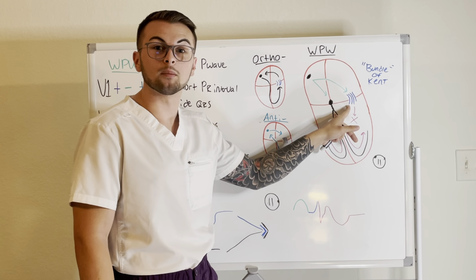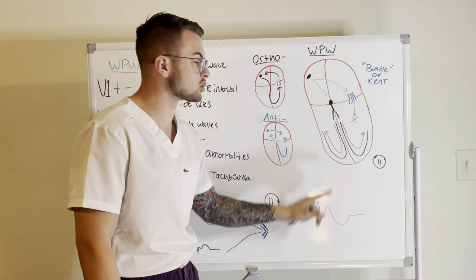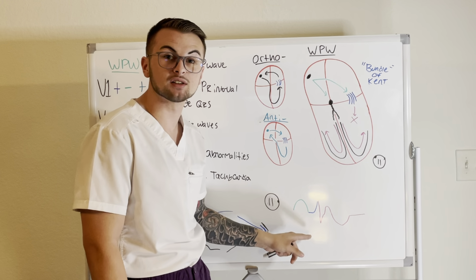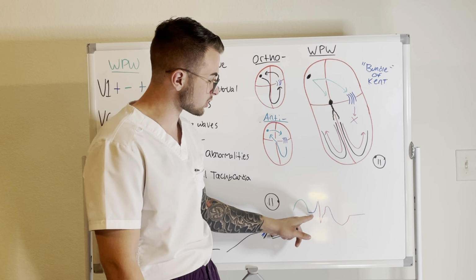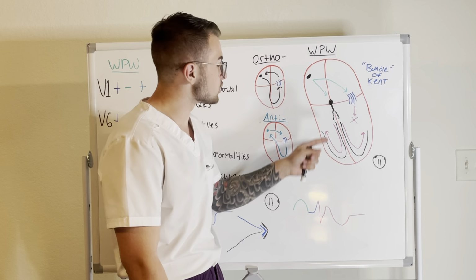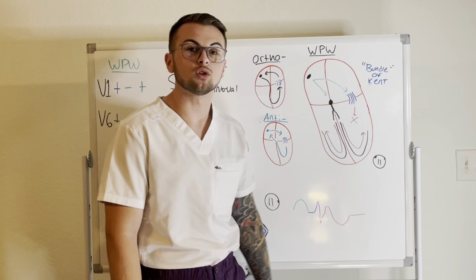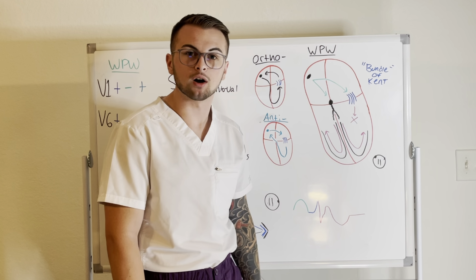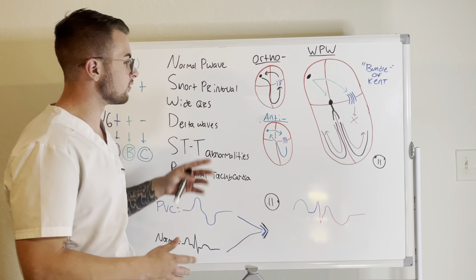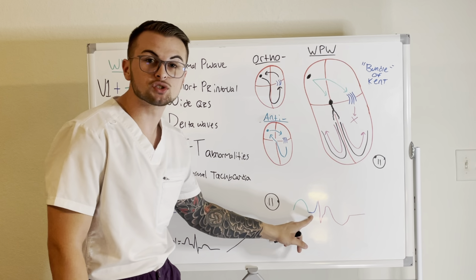Also, because the ventricles are becoming depolarized, it means that we will start to have a positive slurring, right? We are starting to depolarize positive towards a positive, so we have a positive slurring. This occurs for some time until the AV node finally conducts its impulse and it travels along the rapid conduction system in the ventricles. Therefore, we have a normal QRS complex. So, we call this positive slurring a delta wave. Remember, we'll have a wide QRS complex, right, due to this delta wave.